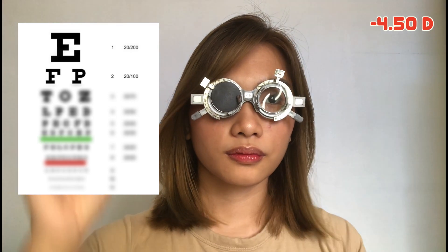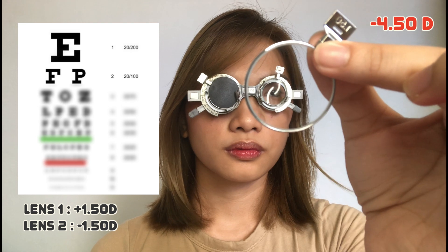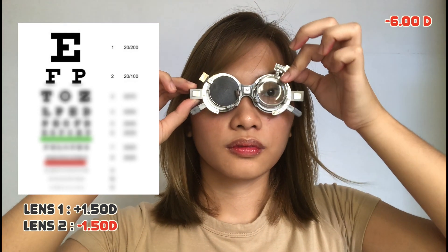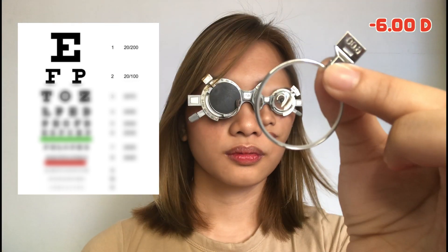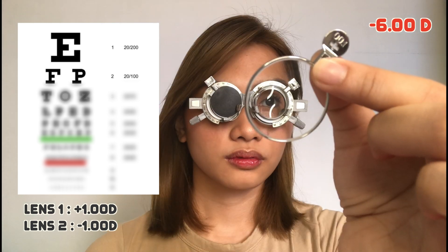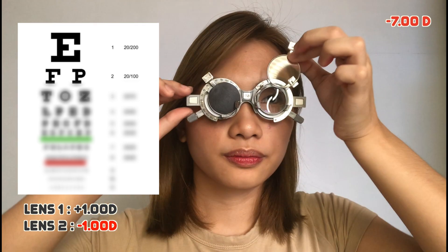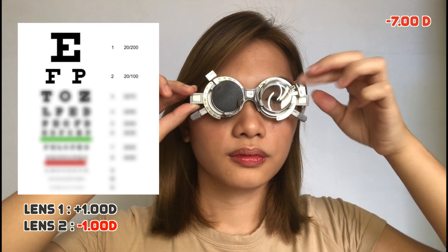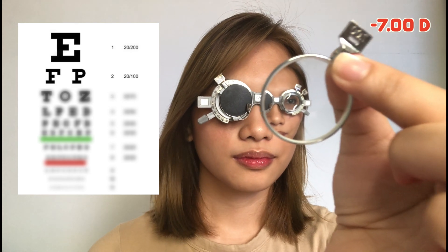Ask the patient which lens is better — Lens 1 or Lens 2? The patient chooses Lens 2 and can now slightly see the 20 over 70 line, with a lens in place of minus 6 diopters. Ask the patient again which lens is better. The patient chooses Lens 2 and can now slightly see the 20 over 70 line, with a lens in place of minus 7 diopters.